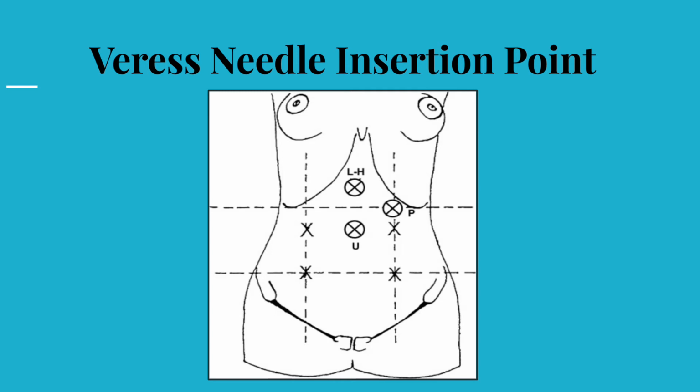But just before we go into the detail of the insertion technique, this is a diagram which shows a few examples of Veress needle insertion points, such as the Palmer's point, Lee Huang's point, and the umbilicus respectively.